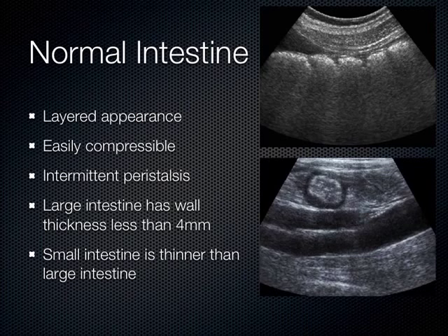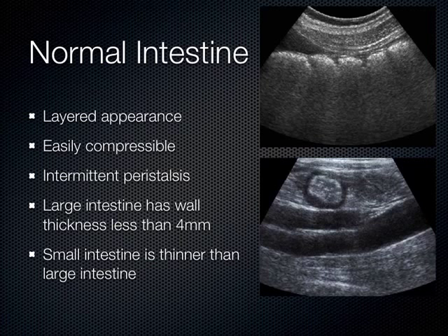Normal intestine has a layered appearance and is easily compressible. You'll see you compress on those loops of bowel — they just squirt closed with no problem. They peristalse every 10 to 20 seconds. That's normal. With disease states of the bowel, you can see hyperperistalsis initially and then eventually aperistalsis — no movement at all of the bowel.